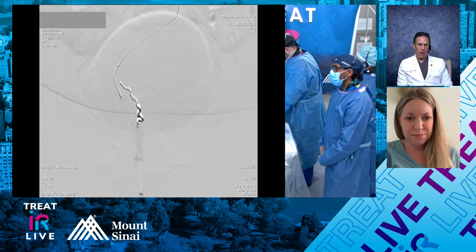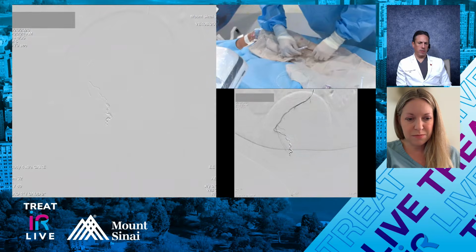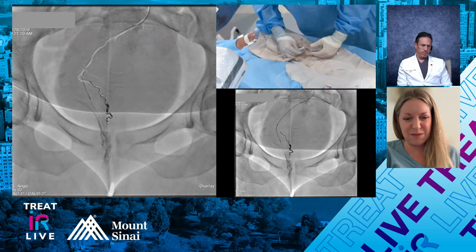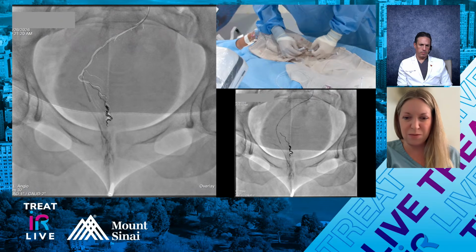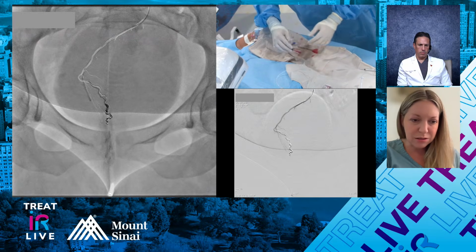How often are you doing secondary angios in the internal iliacs to look for the middle rectals? I would say maybe 20% of the time, something like that. Oh yeah, speak of the devil. You see that?